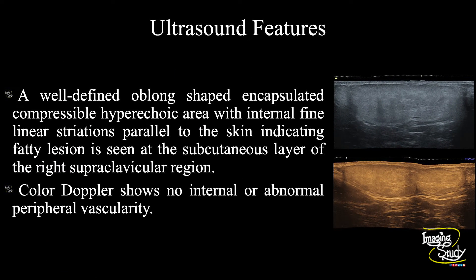In summary, a well-defined oblong-shaped encapsulated compressible hyperechoic area with internal fine linear striations parallel to the skin, indicating a fatty lesion, is seen at the subcutaneous layer of the right supraclavicular region. Color Doppler shows no internal or abnormal peripheral vascularity. These features conclude this as a case of superficial supraclavicular lipoma.